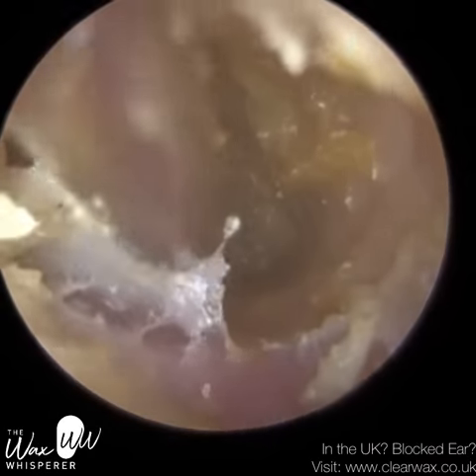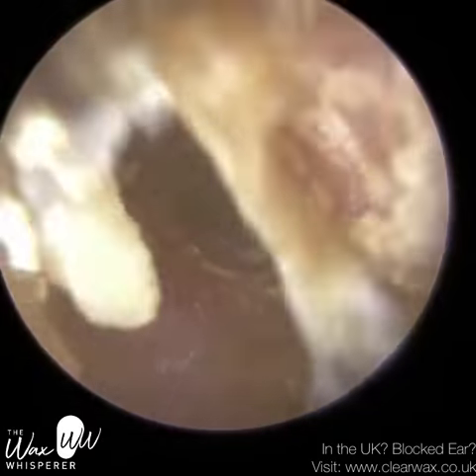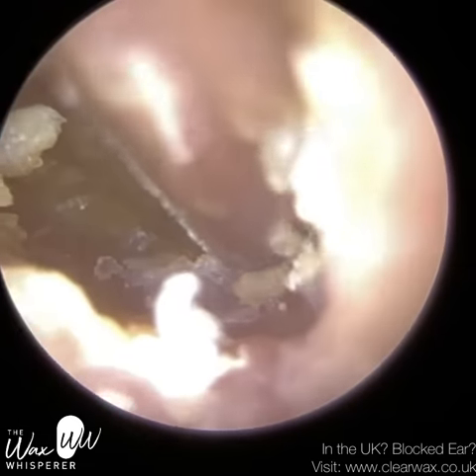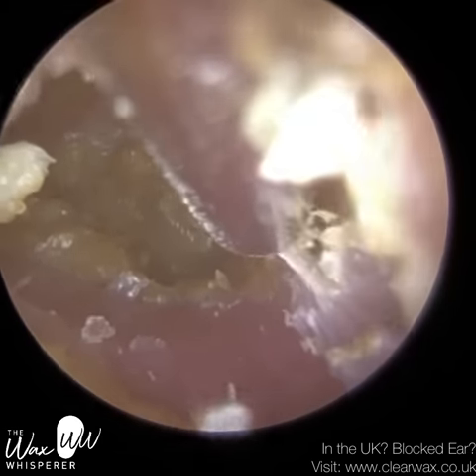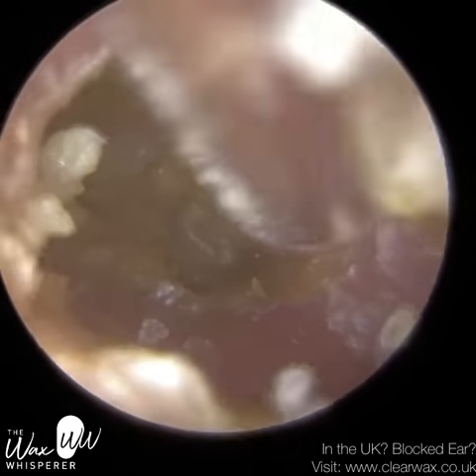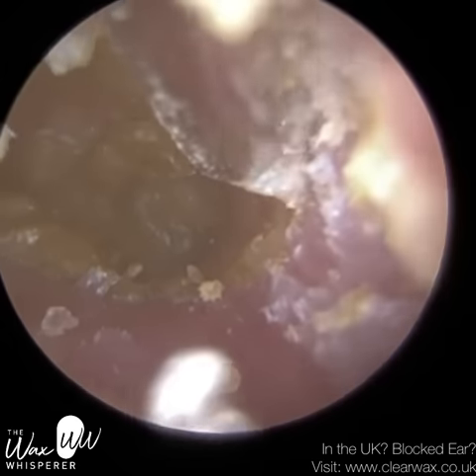I've just gone to the front part of the ear canal and we're quite deep in the ear now. I've managed to get hold of a sheet of dead skin and I'm just trying to peel it away from the canal wall. Even at this stage the patient is able to hear significantly better. Although the video length is about 33 minutes, in reality the patient was sat in the clinic room for between 50 minutes to an hour. On occasions I had to come out with the suction probe to unblock it. There were also occasions where we had to soak the ear with the drops and let it sit for a few minutes.